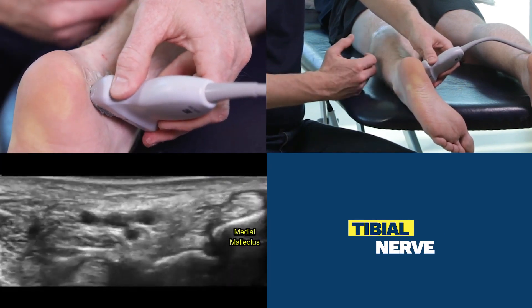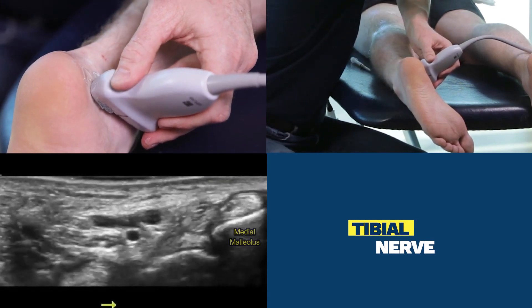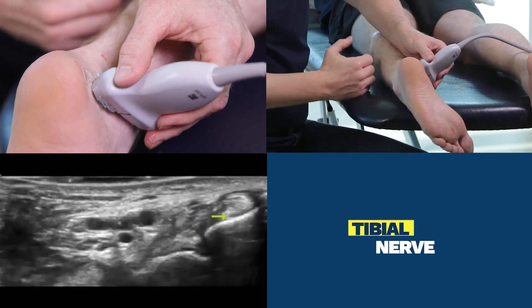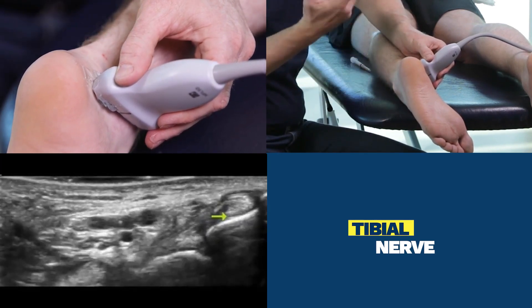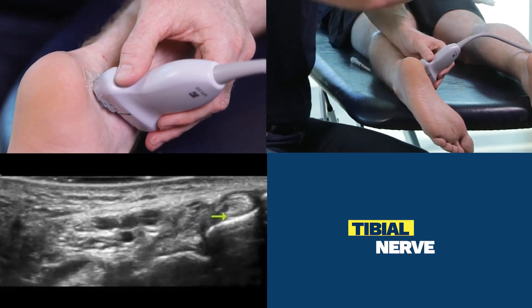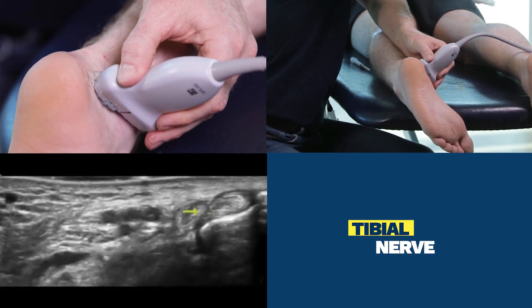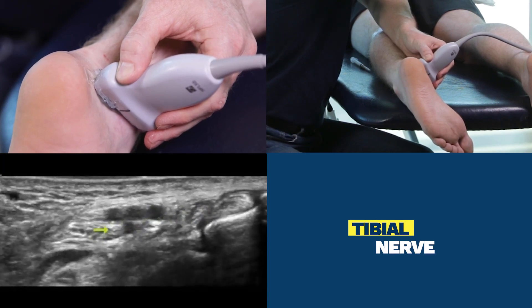We now see the medial malleolus on the left hand side of the screen. The yellow arrow is pointing at the tibialis posterior, and we know the mnemonic for the medial ankle is Tom, Dick, and a very Nervous Harry. So here's our tibialis posterior, our flexor digitorum longus, the artery, the vein, and there's your tibial nerve here.